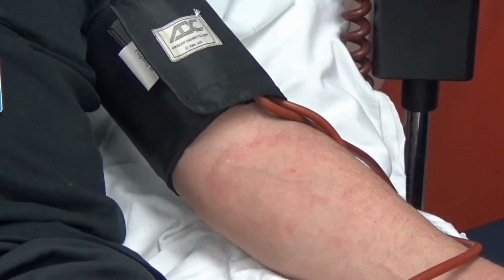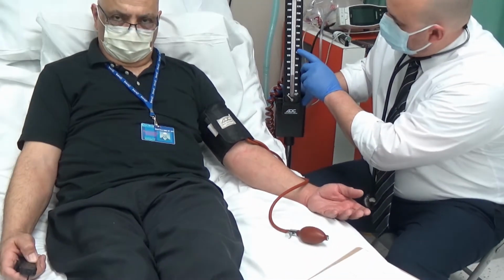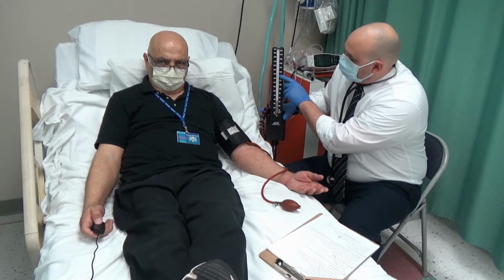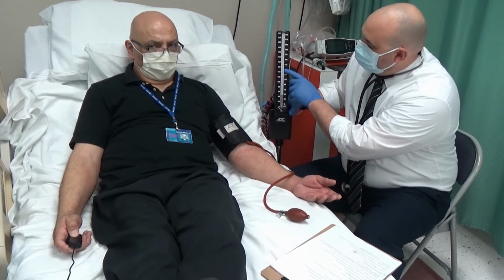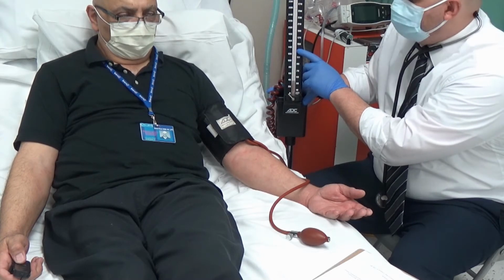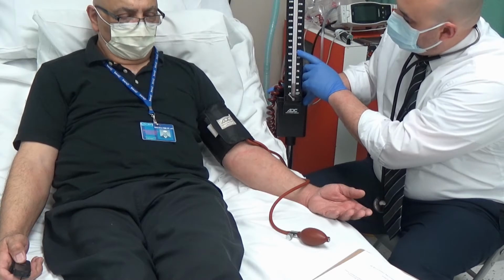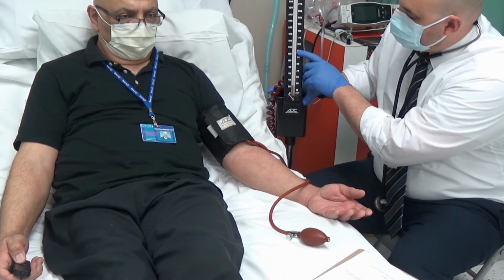The reason you have your stethoscope on is because what you're listening for is, as I pump up to about 180 and slowly release the balloon, you hear nothing, okay? Then all of a sudden you'll hear a beat. That very first beat that you hear is actually your systolic pressure. I heard it right around 128, 130. So that is systolic.